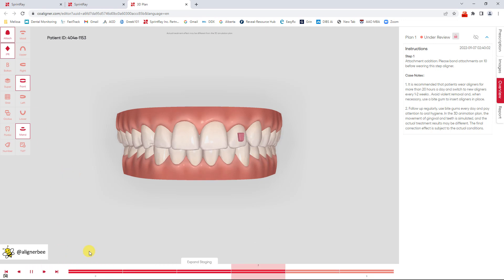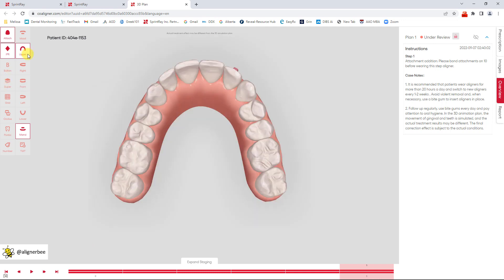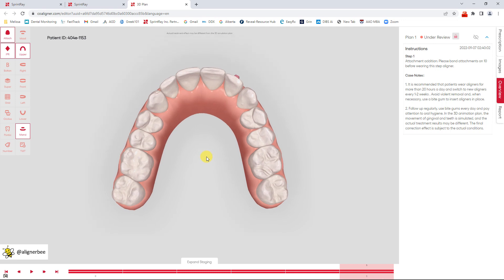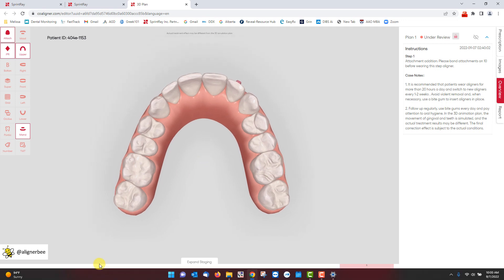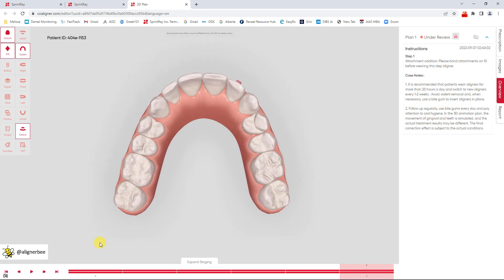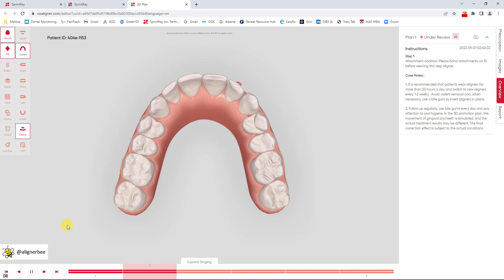I'm going to play through it like a video one more time so I can see where some of the movements are and then I'm going to go to the different views. Go back to the beginning and then play through again so I can see more of the tooth movement.